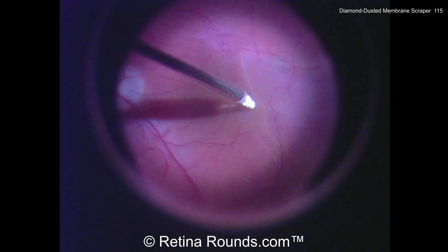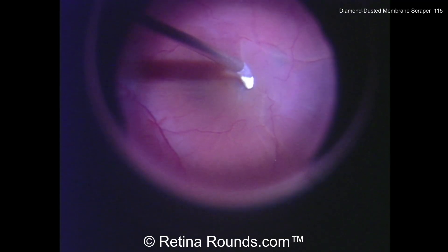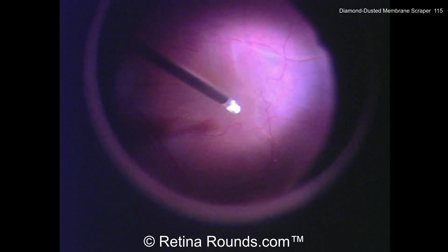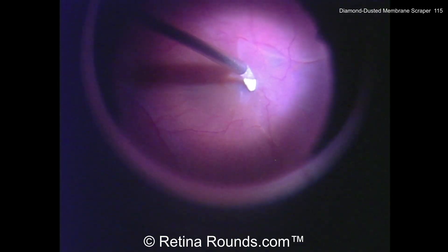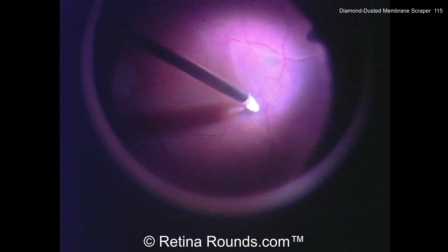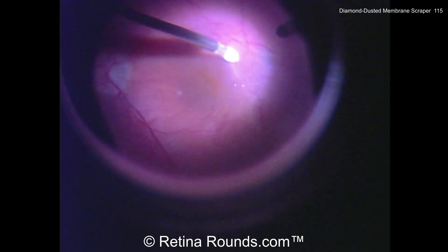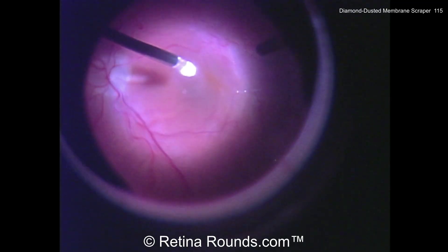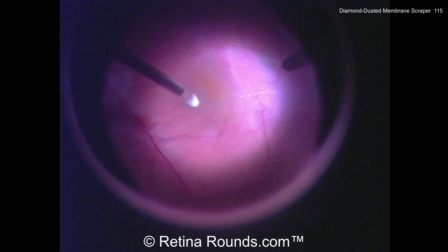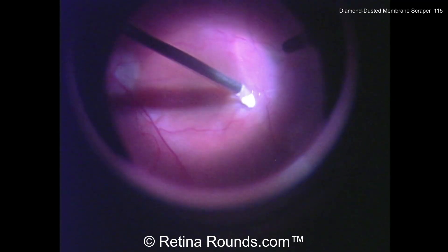You can see here this Tano diamond dusted membrane scraper, and depending on the manufacturer, there are extendable options for this instrumentation. The end of the scraper has a flexible tip, and so as it's rubbed up against the surface of the retina, the fine particles at the end can be used to abrade an epiretinal membrane and elevate up an edge of the epiretinal membrane.